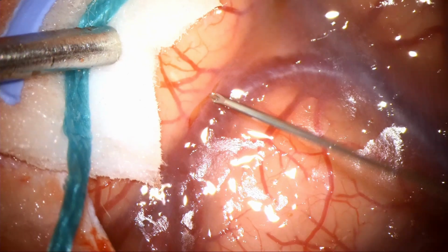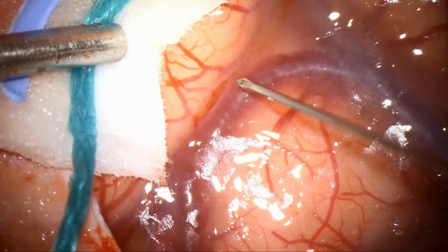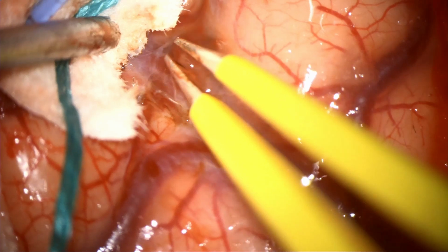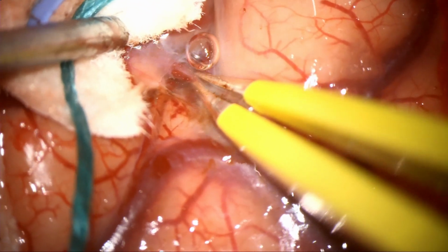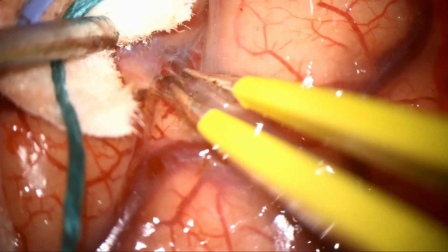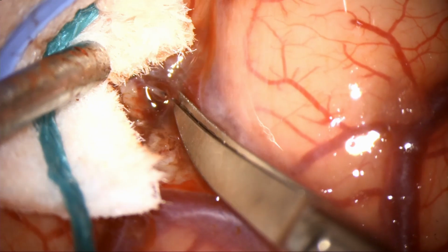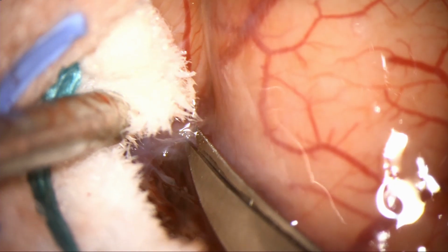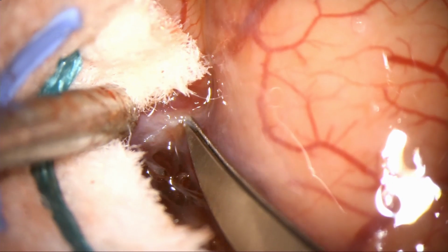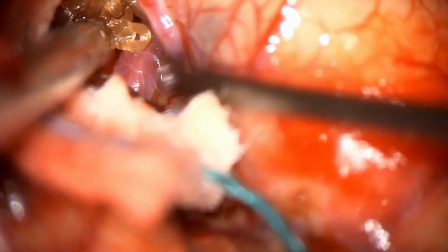Here is a mini pterional craniotomy completed, approximately 3 by 3 centimeter in size, and sharp dissection of the arachnoid plane is started to separate temporal and frontal lobes. 1 to 2 small veins crossing from frontal to temporal side can be sacrificed. Because this is a prior ruptured aneurysm, you can see that the arachnoidal adhesions are very tough, and most of the dissection has to be performed sharply.